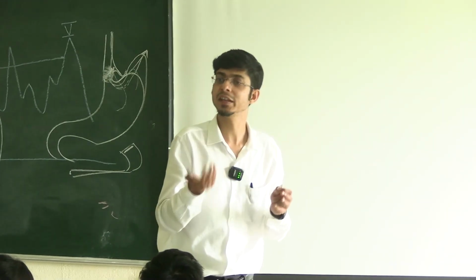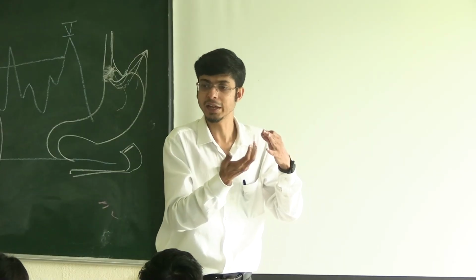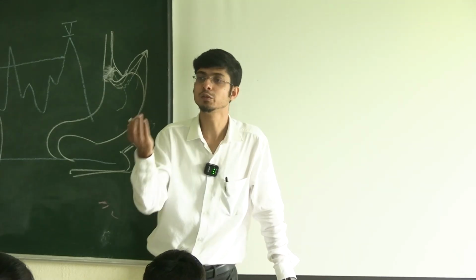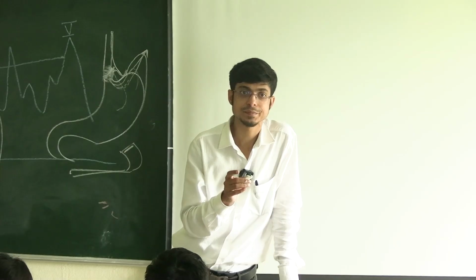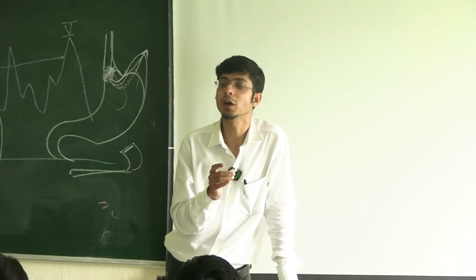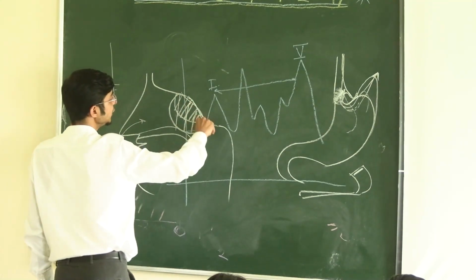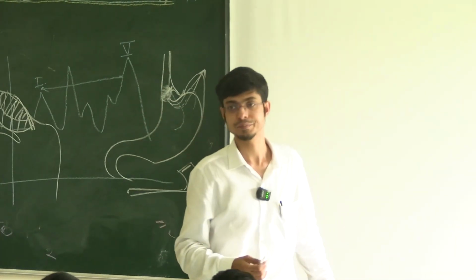So coblation is basically a radio frequency technique. It creates a plasma between the tissue and the probe, and it evaporates the tissue. It eats up basically. So with coblation we usually eat up the adenoid tissue, and we don't have a capsule like I said. Okay, so we have to be very careful about how much tissue we are removing. The buccopharyngeal fascia, the fascia that comes here posteriorly, is typically a whitish plane. We usually take it out in that plane.